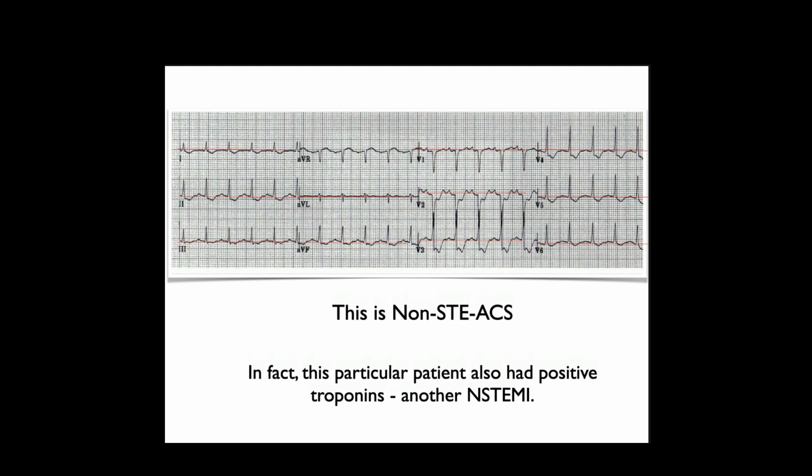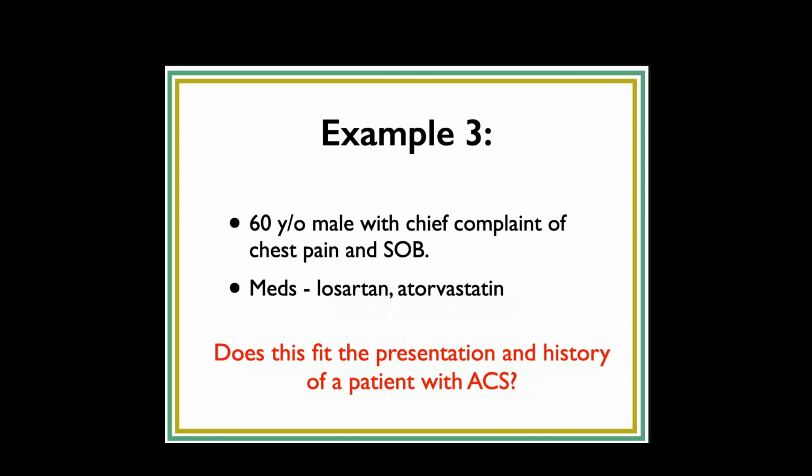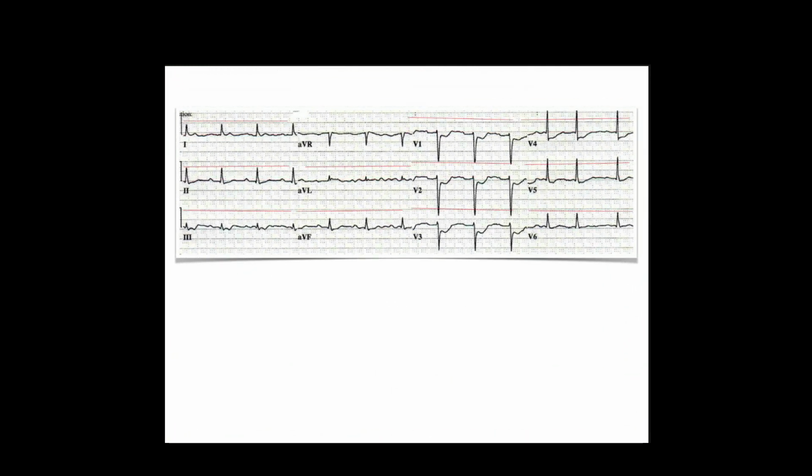So this is non-ST elevation. Again, history, presentation, check. 12 lead, ST depression all over the place. Again, this was another NSTEMI when they were taken in. Okay. Koa, does this patient fit the presentation and history of a patient with ACS? Yes, absolutely.